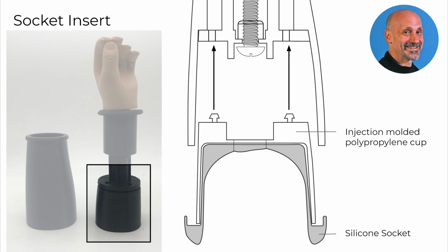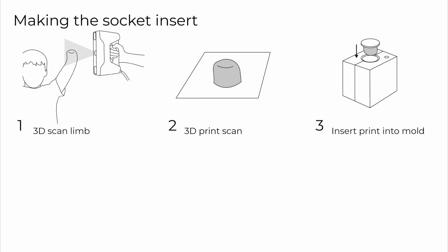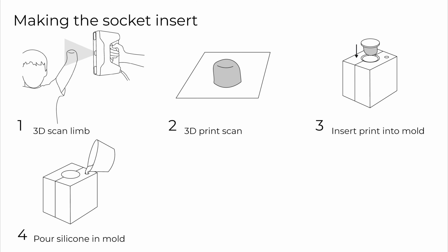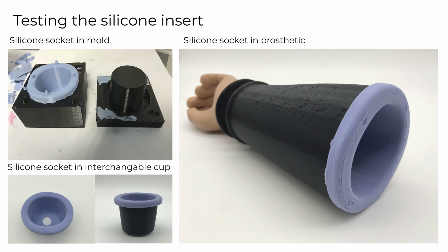When the prosthetic specialist believes it is time to change the socket, instead of getting an entirely new prosthetic, the only part replaced is the socket insert. The socket insert is a special fit per patient through a 3D scanner, which prints a model of the limb. This is inserted into a mold that then casts the silicone to produce the appropriate socket shape and then fits right into the forearm. Here we are testing the silicone insert.